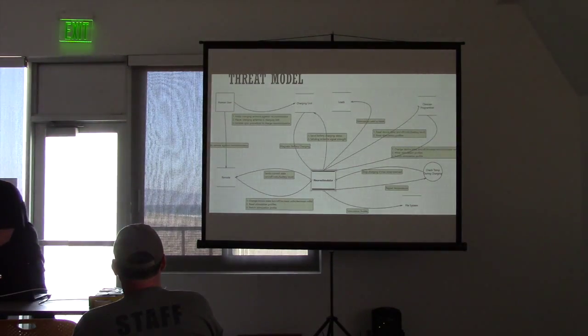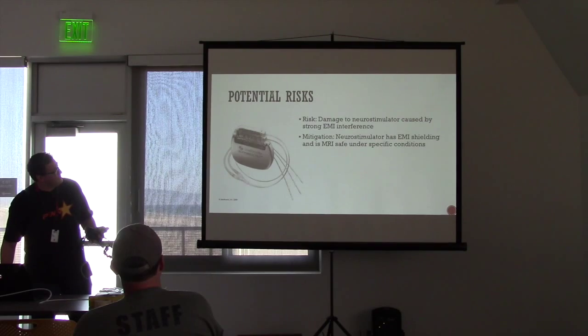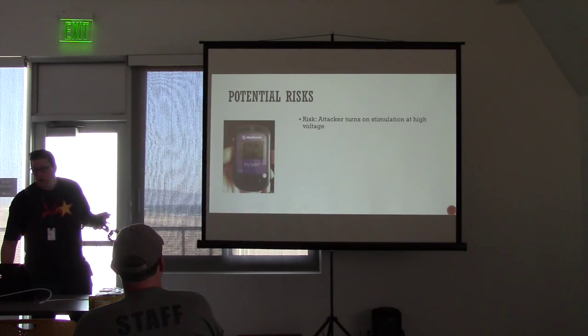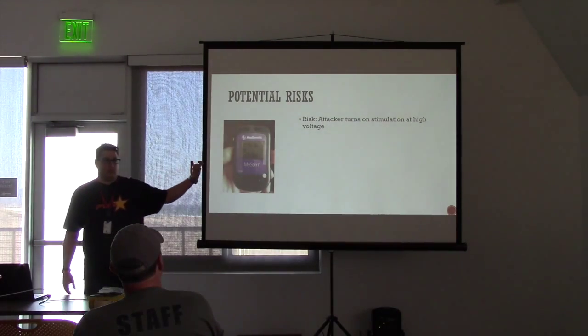This is the charging remote, so it's much smaller than this one. It looks kind of like the one I showed in the pictures. It's the only thing that she uses aside from charging. Is that a spare? No, this is the only charging unit. So if I lose it, I'm in big trouble. But yeah, this device is what she carries with her.